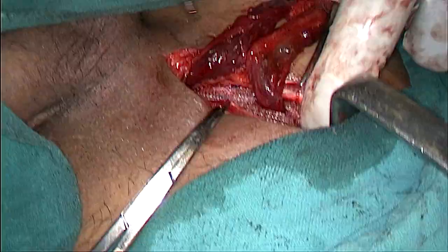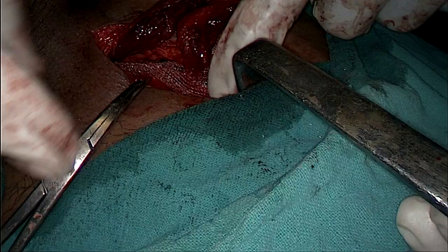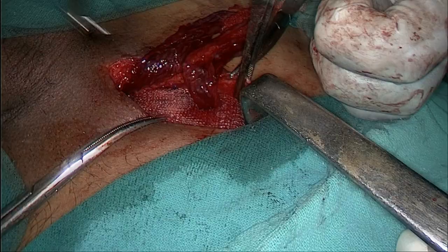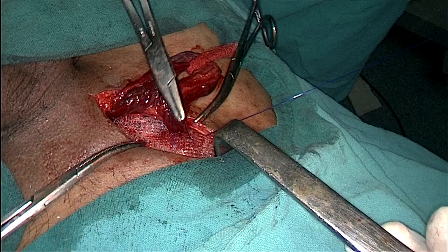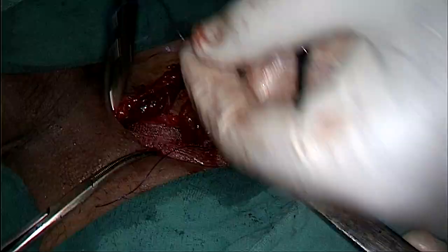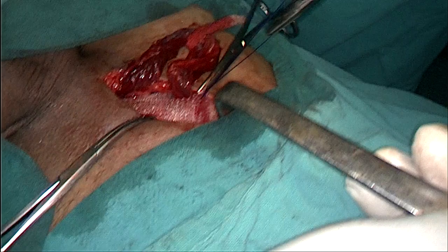Now we are pushing the mesh behind the deep inguinal ring. Try to avoid any wrinkle on the mesh as the patient might complain of pain and discomfort in the post-operative period. As you can see, the mesh is completely settled down. Now we will start taking the suture just behind the deep ring, crossing both flaps of the mesh. These sutures are also considered anchor sutures — the first anchor suture was taken just lateral to the pubic tubercle, and this is the second one. Now we will start fixing the mesh to the medial side.